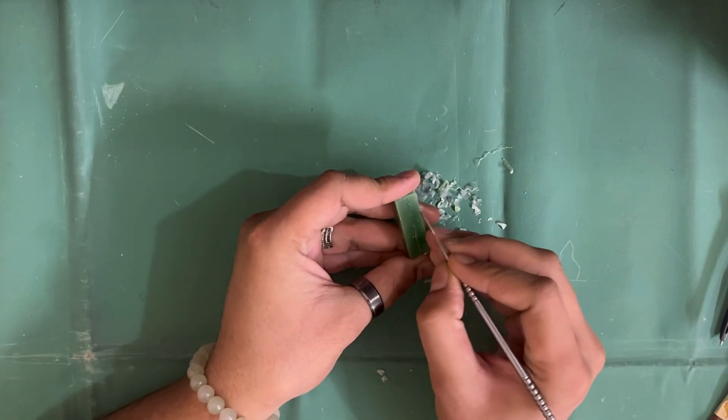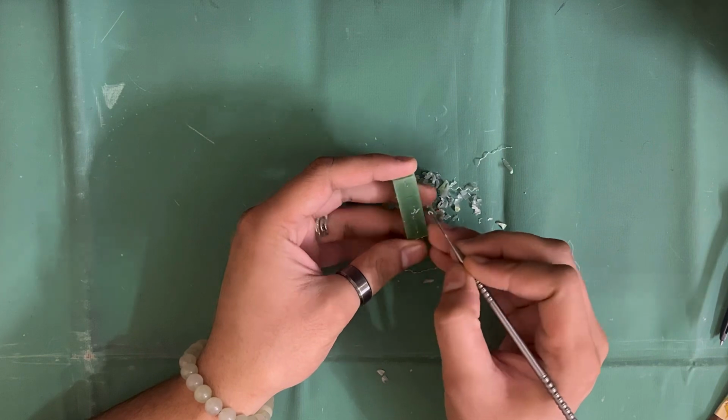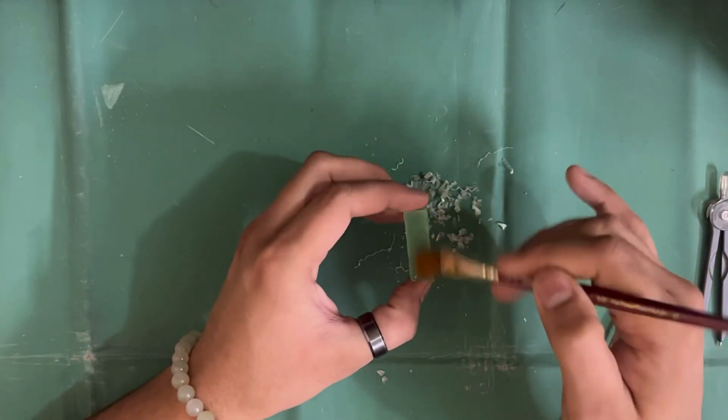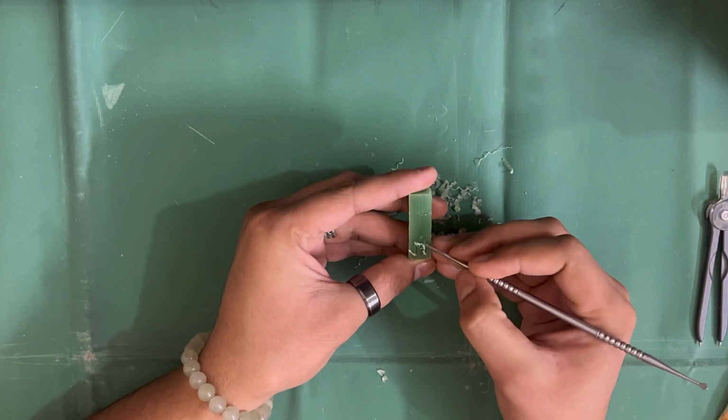So basically, you don't have to take exactly 9.5 or 12.5 here. We can put a little extra, like 10 mm or 13 mm for that. So at least when we carve, we have some space, or we still have a little extra wax.